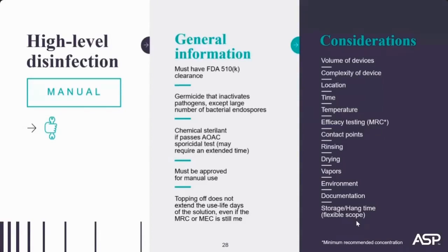Considerations of whether you want to manually reprocess laryngoscopes or bronchoscopes are the following. Number of devices and the complexity. For example, does the device have channels, which makes it much more difficult, much more challenging to reprocess manually? Do you have a way to monitor the time and temperature of the high-level disinfectant? How is the high-level disinfectant going to be tested for efficacy? Will test strips be used? Will the rinsing of the device be done properly? Is there space and setup to do it?